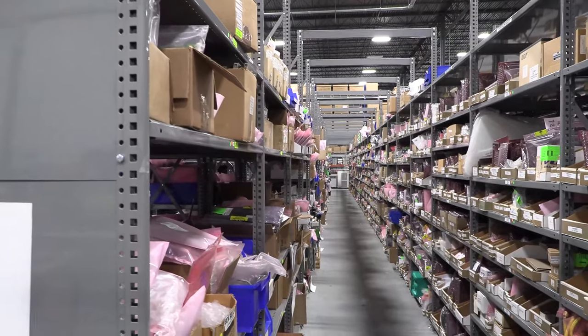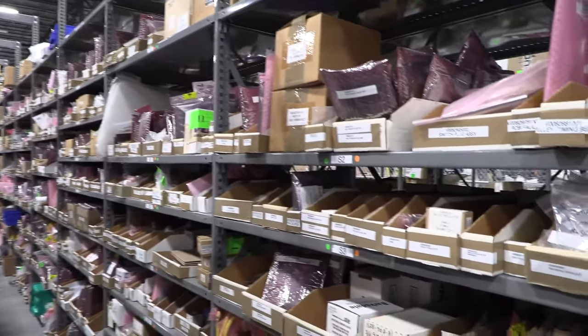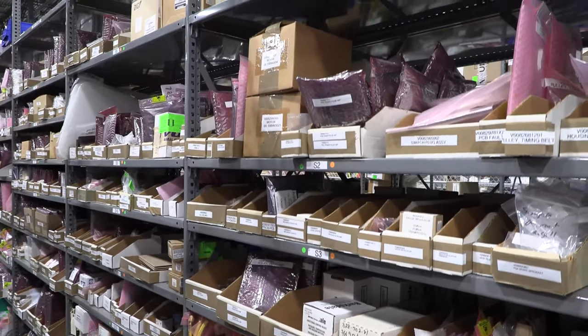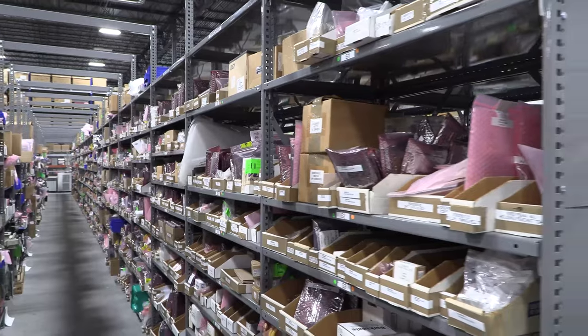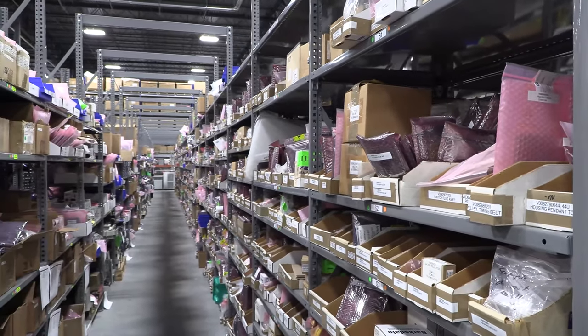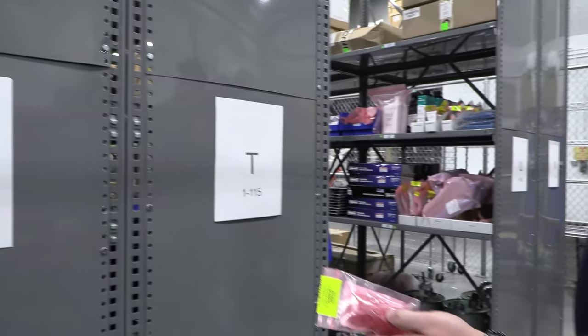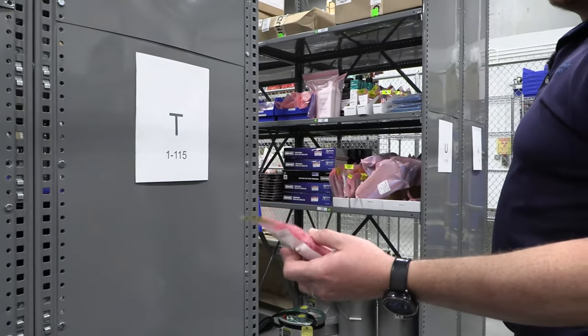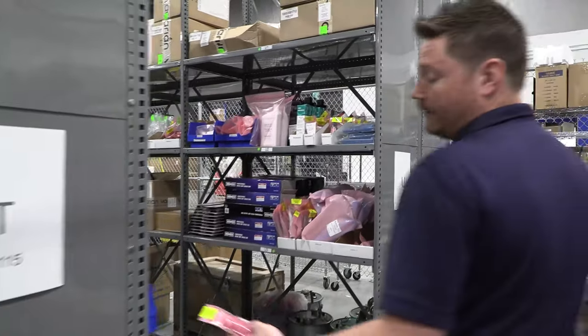That's amazing. So you can see this begins our oncology. Wow, look at all the little bins. Oh yeah, in oncology there are a lot of small parts. One of the fastest turnover products we have are these MLC motors. These are the motors that move the individual blades inside an oncology machine. They go out 25, 30 at a time, so we keep thousands of them in inventory.